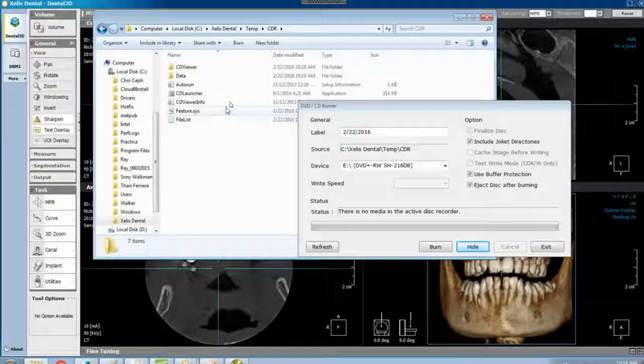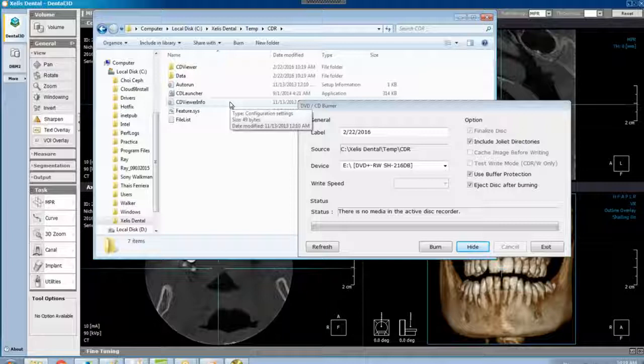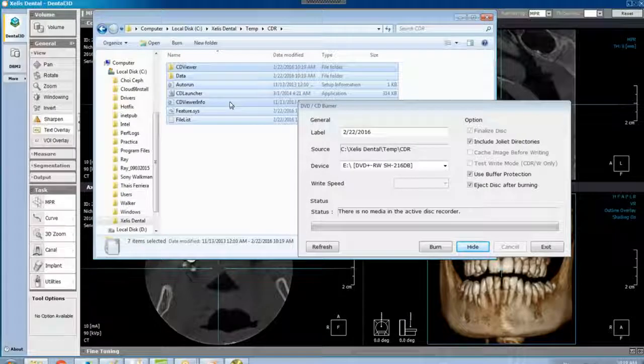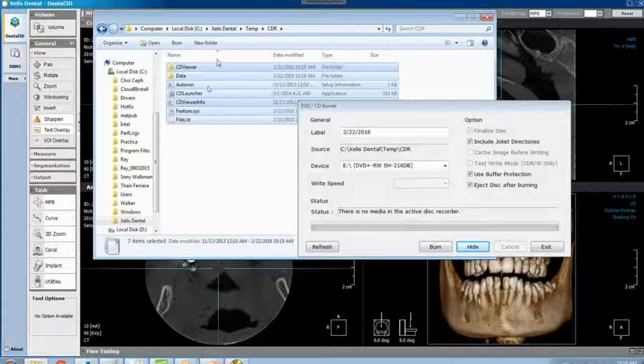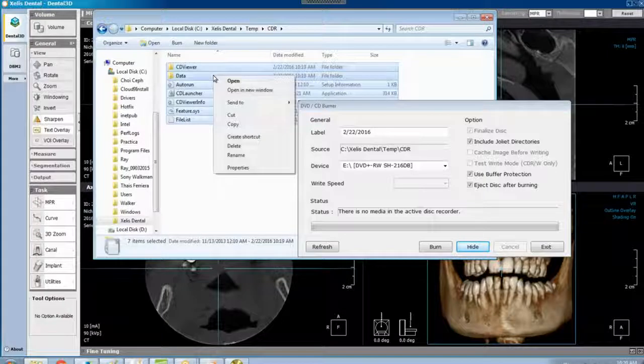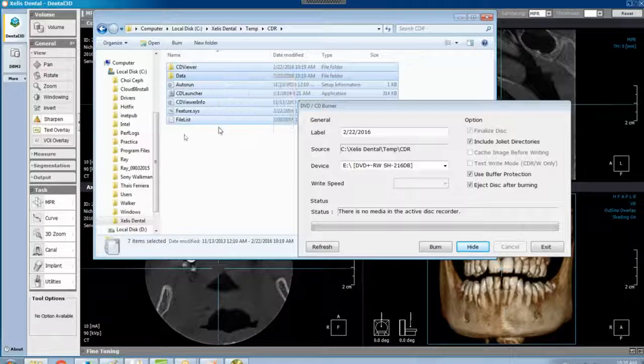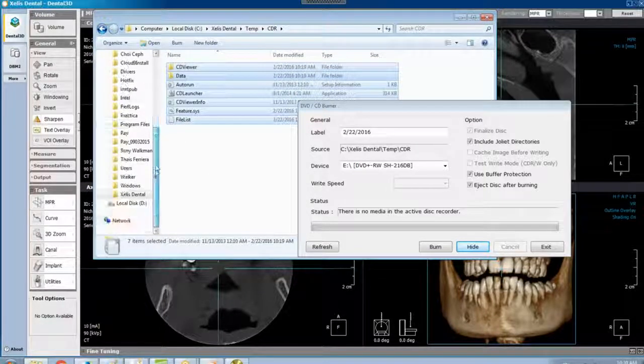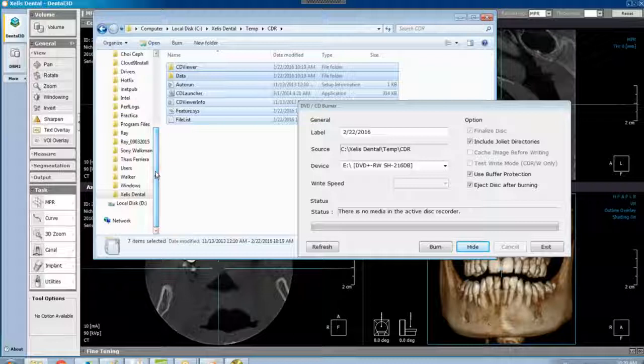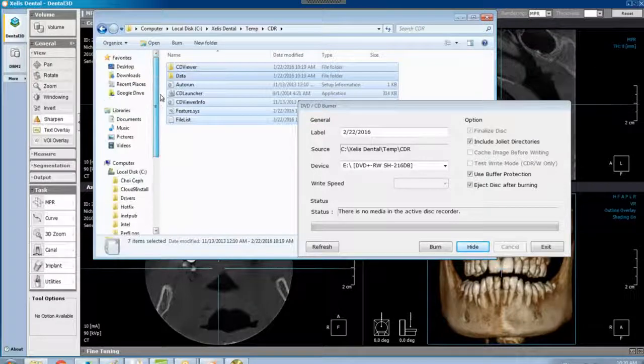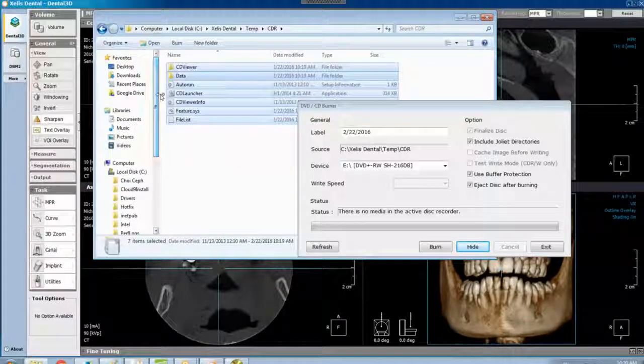From there it's your call. I usually will do control A to select all of these. You can right click and copy and then find your flash drive that you've put in and paste it to your flash drive. It's that simple.